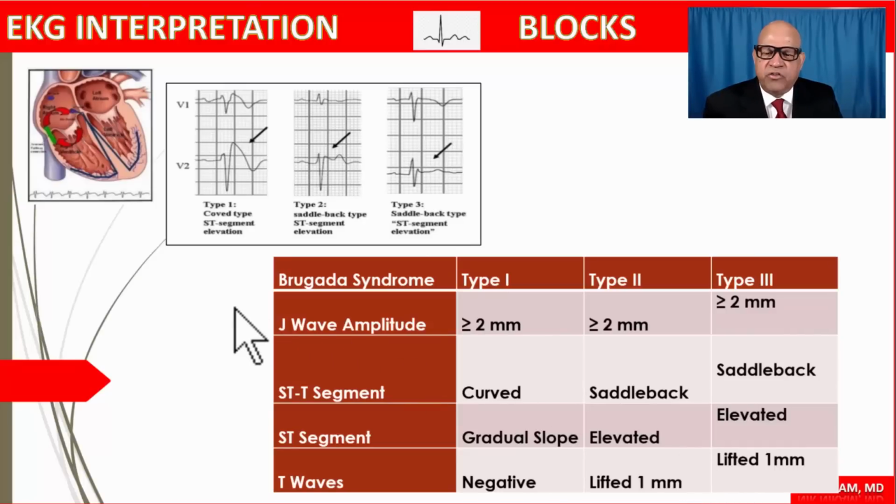Most important thing is to identify this Brugada syndrome and look for other features of Brugada syndrome by doing echocardiography and other tests to make sure these patients are appropriately managed based on these electrocardiographic findings.